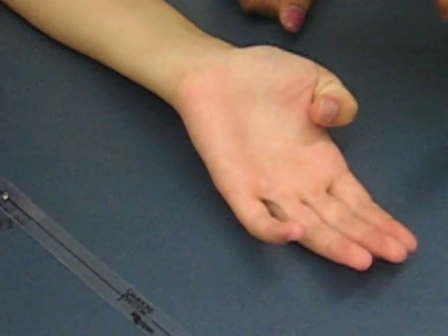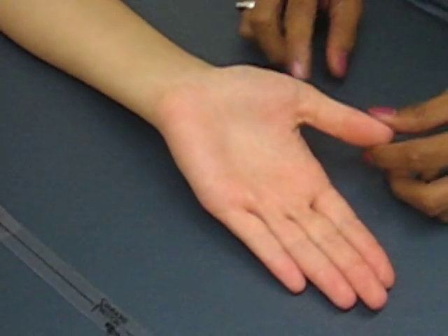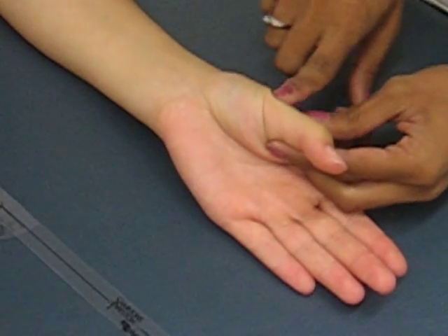Can you please do this motion for me? Good. The axis of rotation is going to be the metacarpophalangeal joint, which is right here.